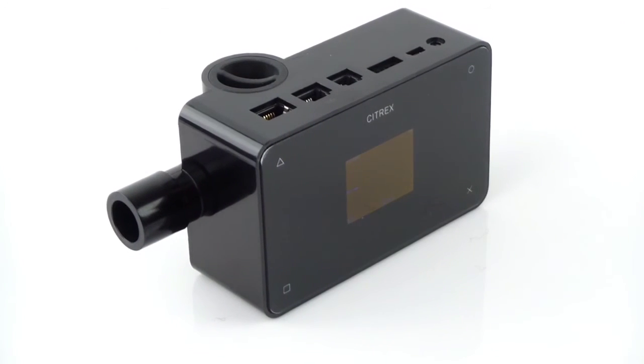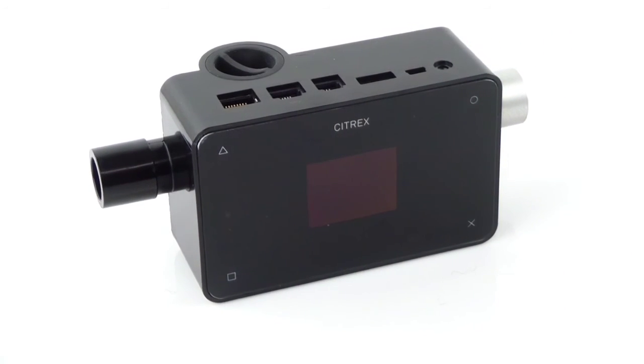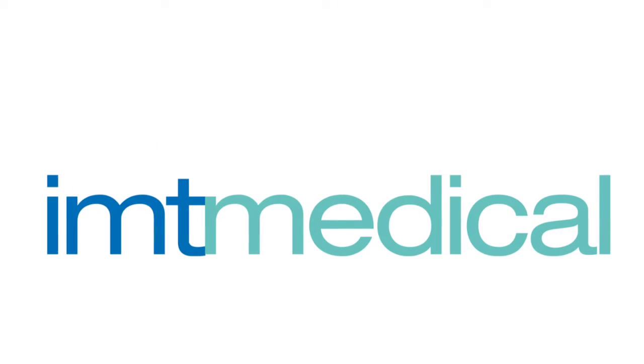Citrex H4 — the most advanced, portable ventilator tester. Simple to operate, compact in its size and reliable.